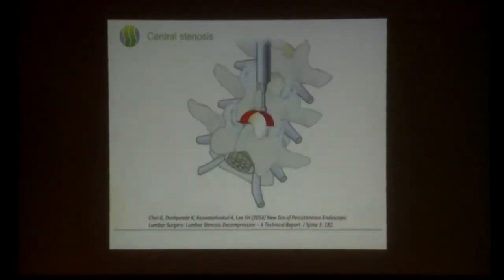Now, if you are using the microscope, obviously with the tubes you have to fix it. Then you can use the endoscope only under the microscope. If you are using it without the microscope, it's very dangerous. With the endoscope, the advantage is you are holding it with one hand, and you can go medially, laterally, to the opposite side. You can go either way. So that's the great advantage of the endoscopic discectomy. Initially, they were not having all these instruments and it was very difficult. That's why the neurosurgeon board moved to the tube. But with these drills, with these endorongers, you can do anything.